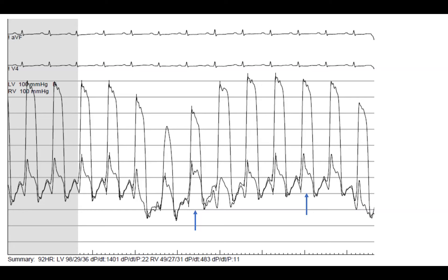This feature is supportive of constrictive pericarditis. However, it is non-specific — you may see it in RV failure and in restrictive cardiomyopathy. Typically in RV failure and restrictive cardiomyopathy, you do get end-diastolic equalization, but when they separate, it's usually the RV that is higher than the LV. The fact that the LV is higher than the RV here is also suggestive of constriction. But again, end-diastolic equalization is not specific.